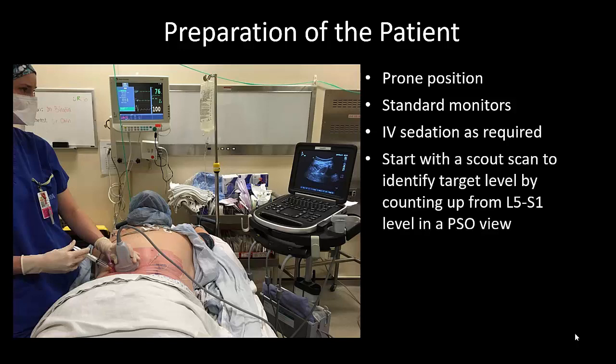We recommend starting with a scout scan using the parasagittal oblique view to identify the L5-S1 interspace and to count up to the desired interspace. For our spinal cord stimulator insertions, this is usually L1-2 or L2-3, which corresponds to the L2 or L3 transverse processes respectively.